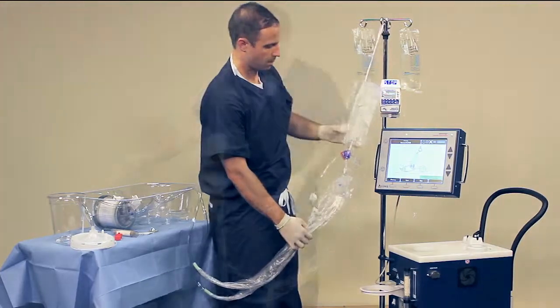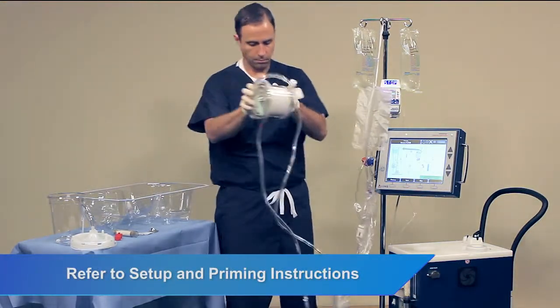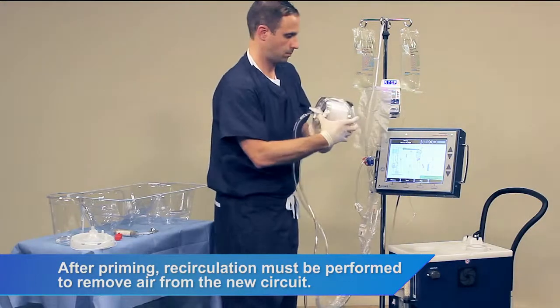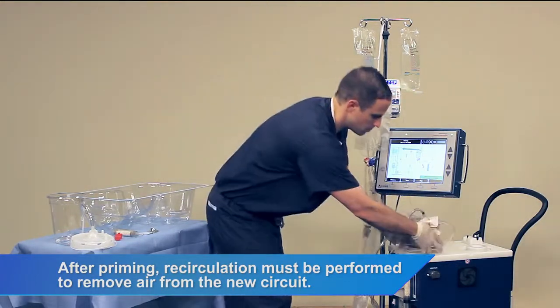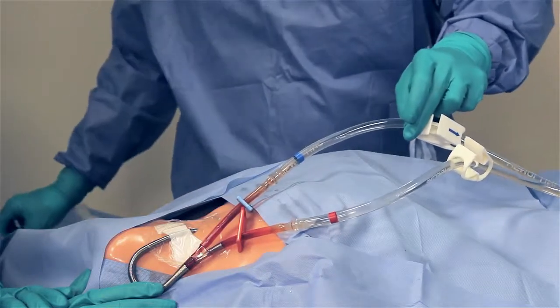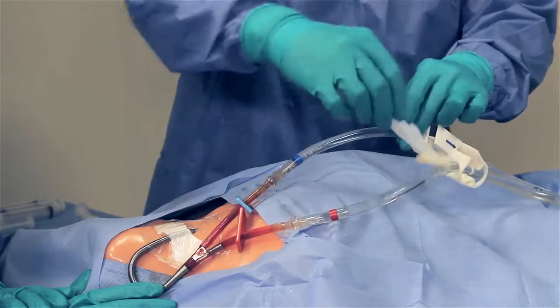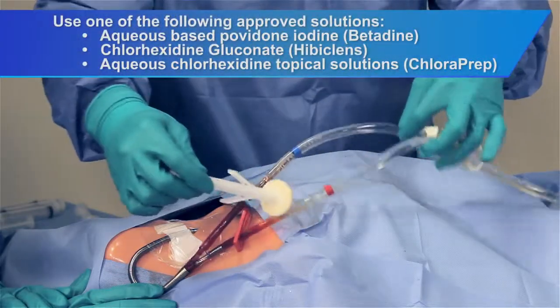Begin by assembling and priming a new cartridge with blood tubing. Next, clean and disinfect a 30 centimeter length of each blood tube, starting on the catheter barbed connector and moving toward the cartridge.